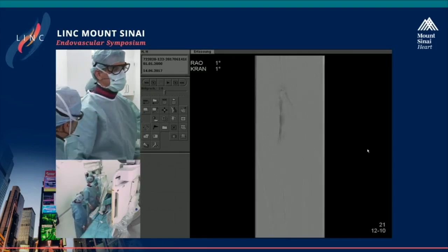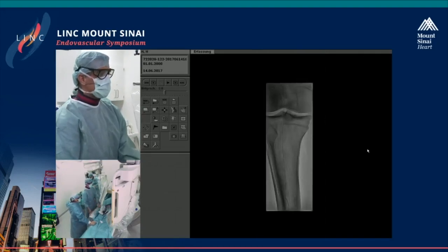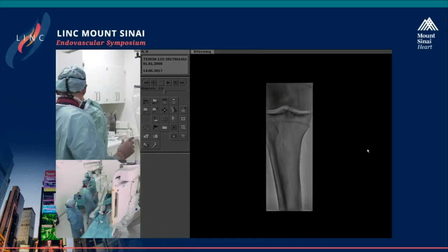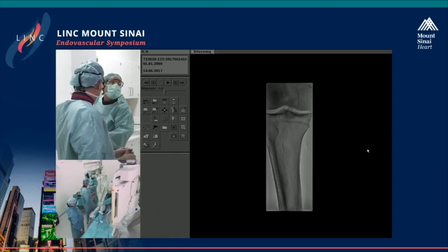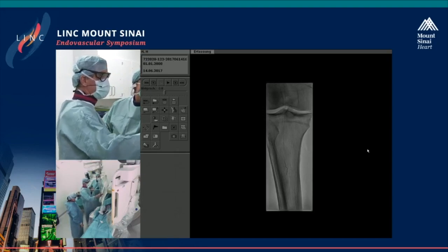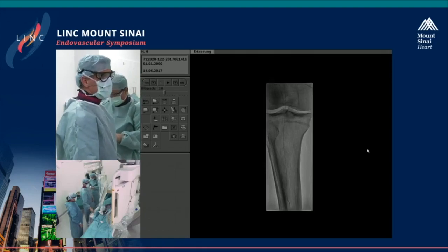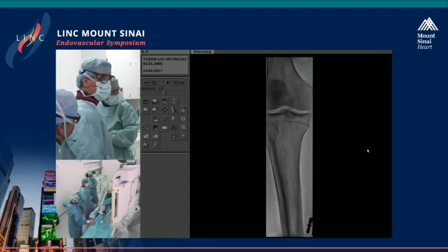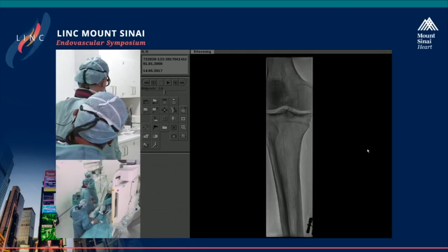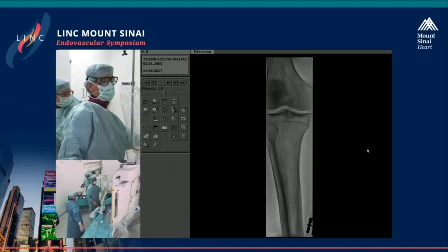Yeah, I mean, you're free to do what you want to do. And we of course try to stay away from stenting in the tibials and in the popliteal arteries. But theoretically, you could also place a stent after, if a bailout stent becomes necessary, or you could upsize the balloon after the treatment. In the protocols for the trials, of course, there's a clear bailout stent criteria, with the intention to minimize this. It could also go to the thrombus. So it's going to be interesting to see the angiogram after the treatment.